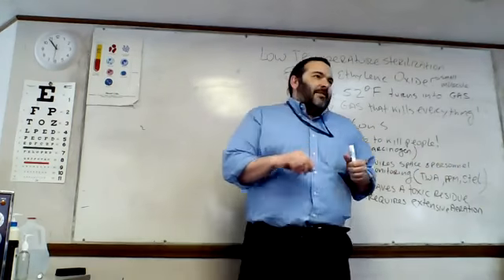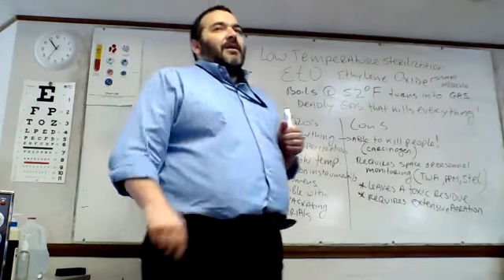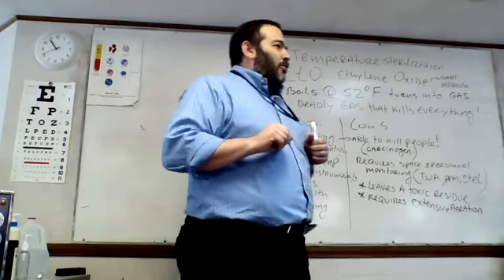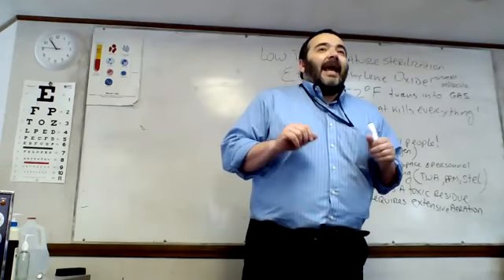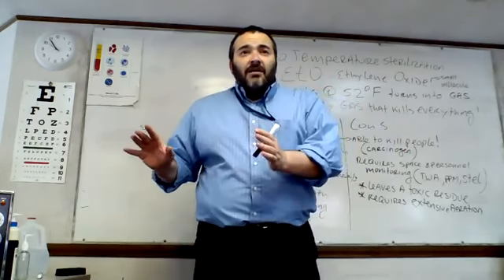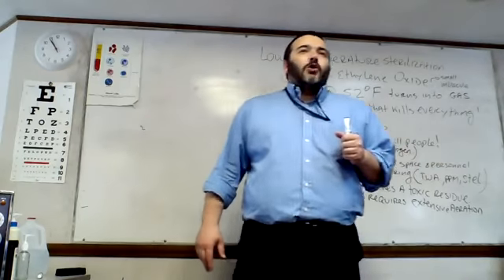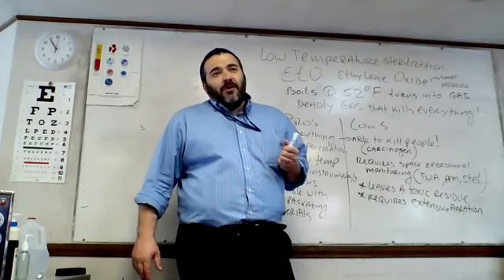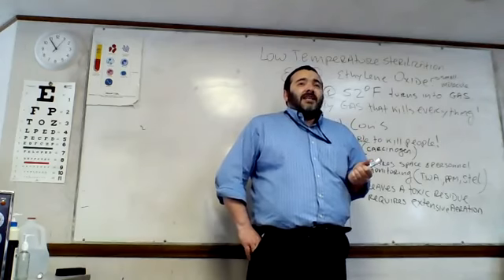So let me tell you something. The process of ethylene oxide sterilization is two-part. Part 1, sterilization or exposure. Part 2, aeration. It's the same as doing your laundry at home. Wash cycle, dry cycle. Now, which cycle is longer? Wash or dry? Dry. Of course. If you do your laundry, you all know that the dry cycle is longer.